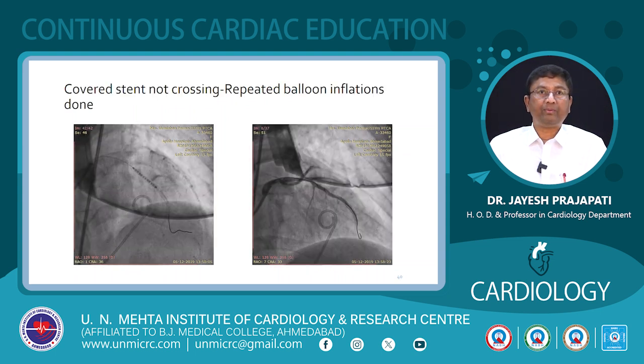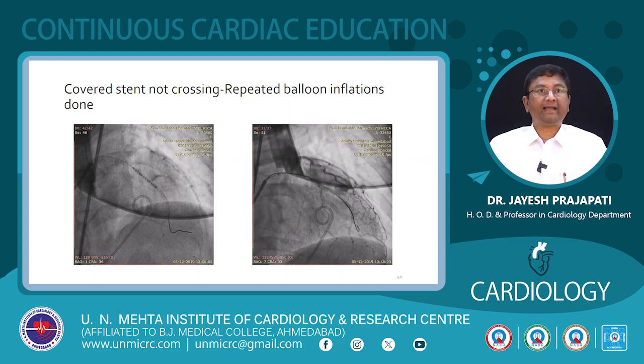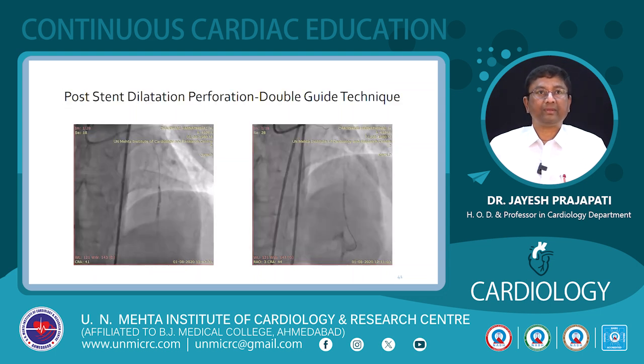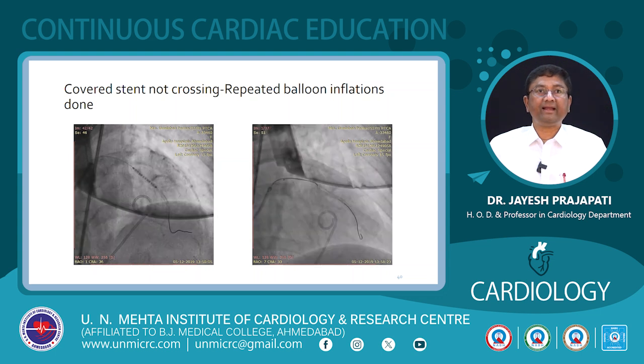I kept the balloon inflated. I tried to put a covered stent, but it didn't go in. Meanwhile, I did a pericardiocentesis, it didn't go very well. Then what I did was repeated inflations, and then see, it has sealed off. See, the covered stent did not go, so repeated inflations and repeated inflations.